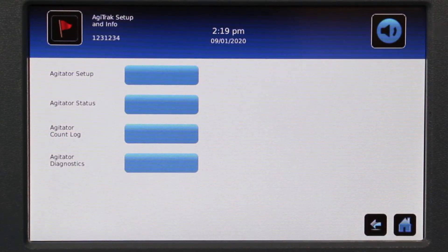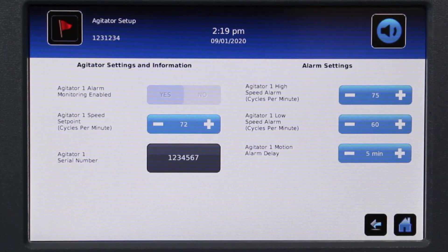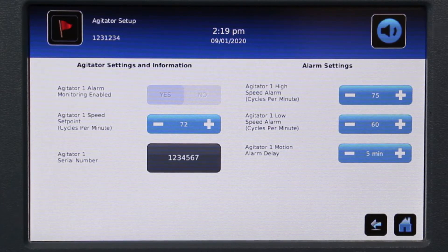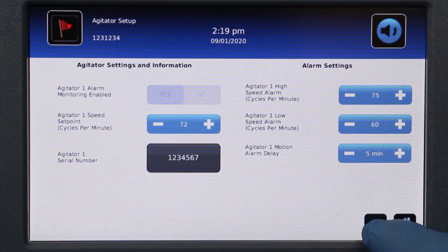The Agitrac Setup and Info screen allows the user to access settings and status information. The Agitator Setup screen allows the user to enable or disable an agitator and control the agitator's speed. Associated alarm settings can be viewed and changed.